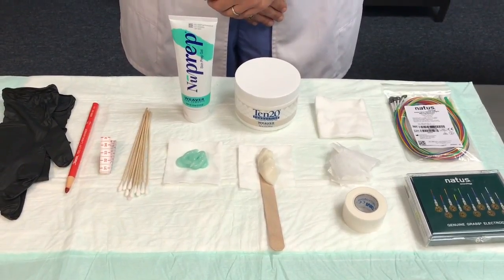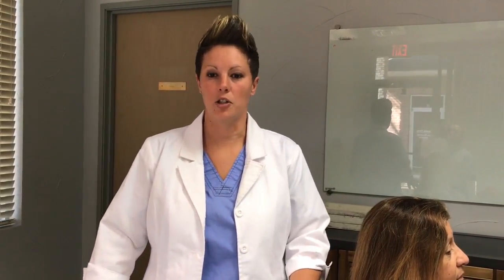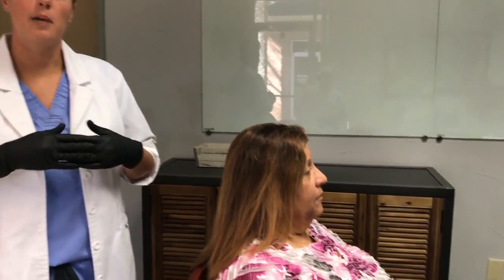This demo is intended as an example. For this demonstration, the steps involve measuring the patient's head, marking the placement location, abrading the scalp, placing conductive paste into the electrodes and applying the electrodes. You can set up your patient with them sitting in a chair or laying down on a bed with the assistance of a neck roll, which you can make by rolling up towels together.